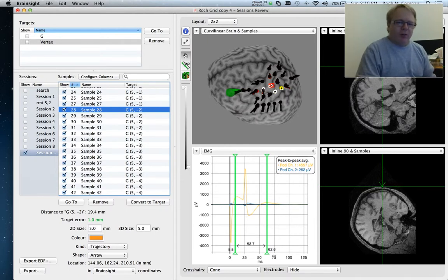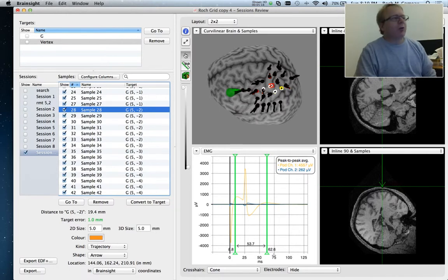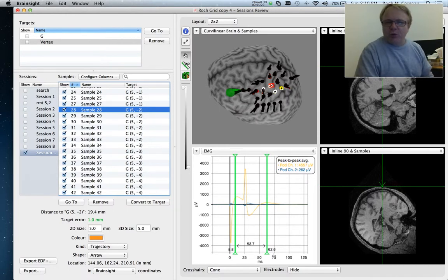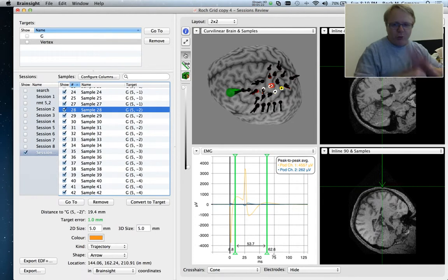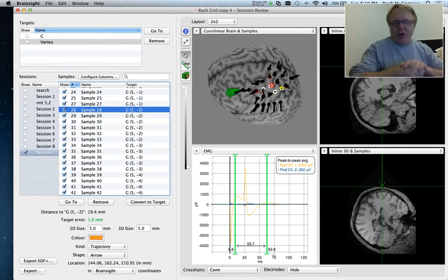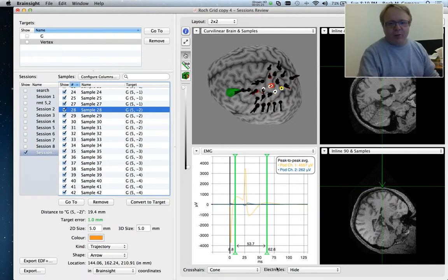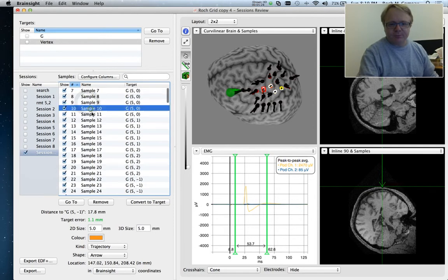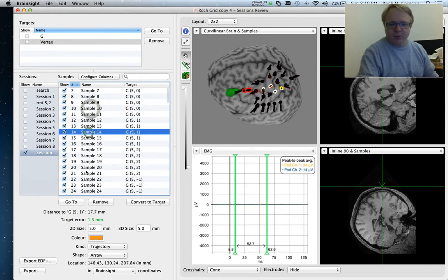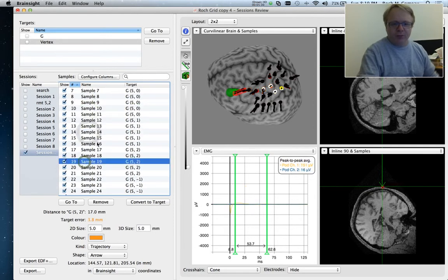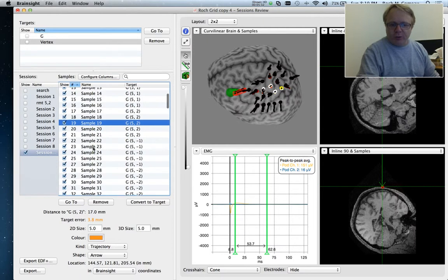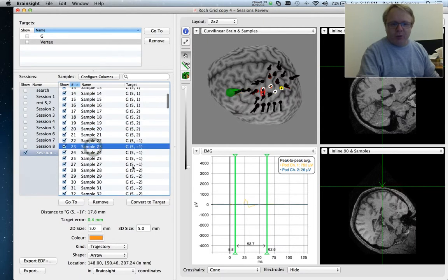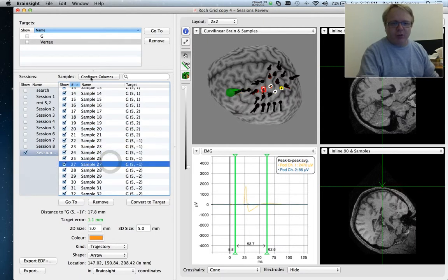Now we have a bit of artifact here. It's actually kind of rare in our system. I think that maybe, if I think back to that session, I was probably pretty sweaty and didn't have the electrodes well placed. And when the electrodes aren't well applied, of course, that will have an impact on the signal quality. Well, these look pretty decent. Now, we can look at them individually, but we can also use this to create some information.